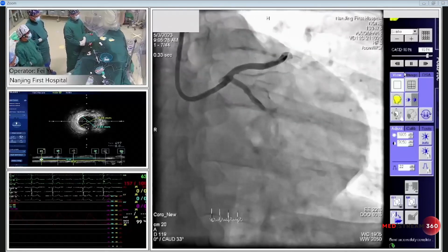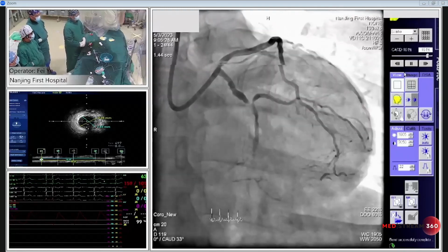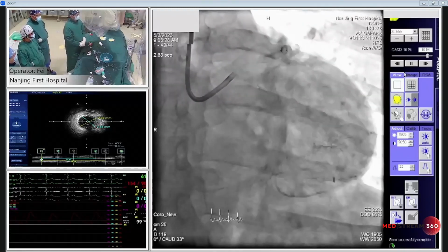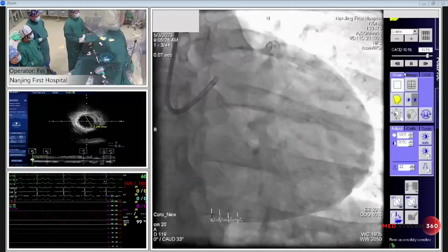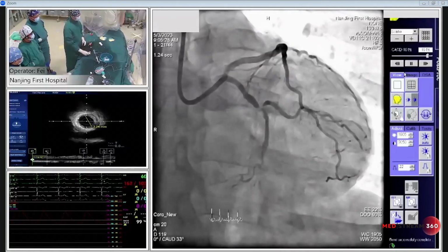One is a distal CTO lesion. Another is a very important, challenging, difficult-to-access circumflex and OM. Before we treat the OM, I think we should successfully open the distal circumflex. So, Dr. Ye, what's your strategy for this distal circumflex?